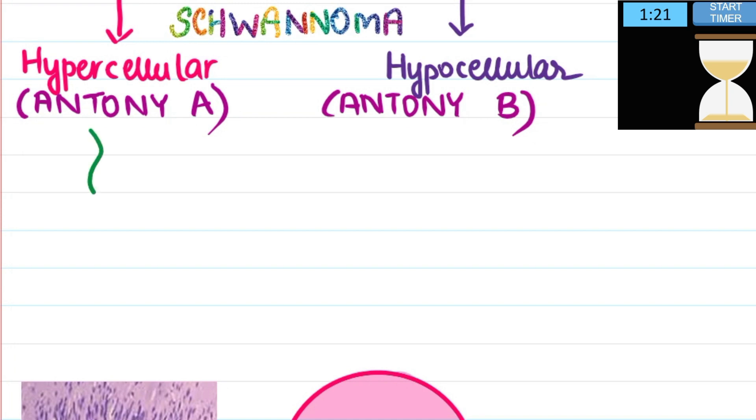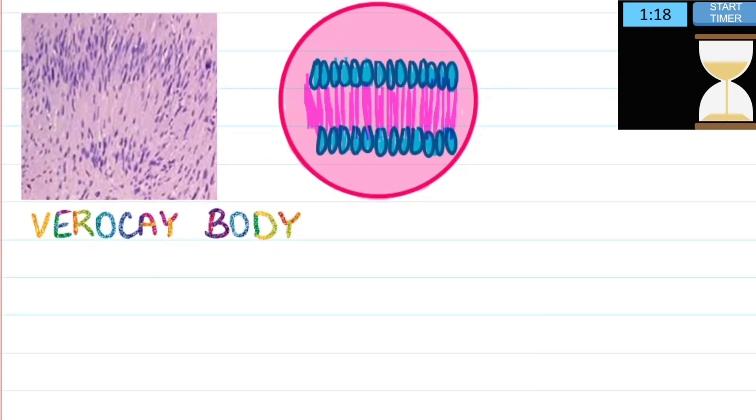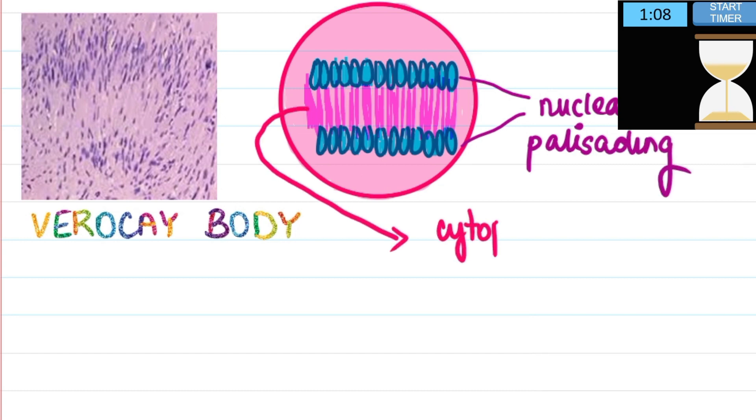What is this Verocay body? So let's see a better image. In the Verocay body you see that we have two rows of nuclei which are showing palisading. They are parallel to each other, nuclear palisading. In between them are present all the cytoplasmic processes. So this is a Verocay body.